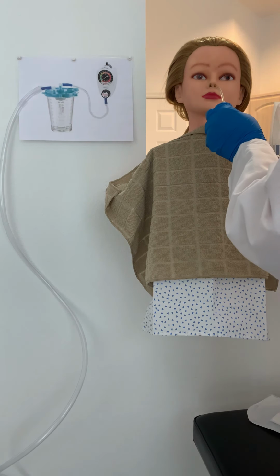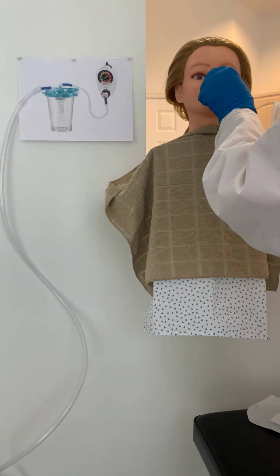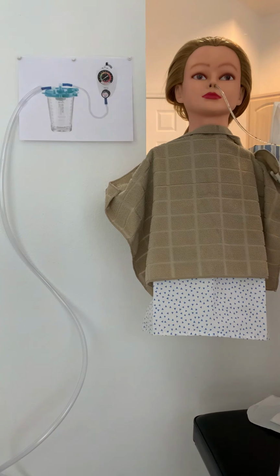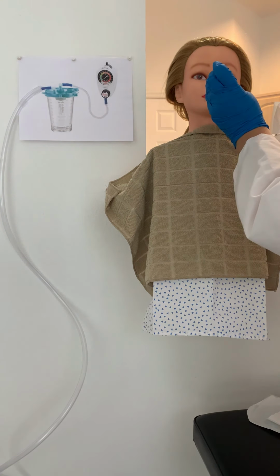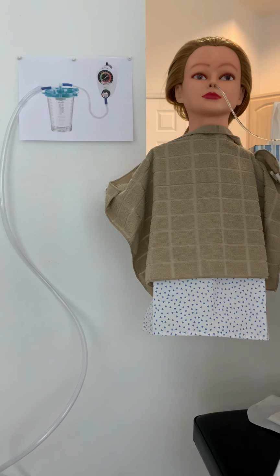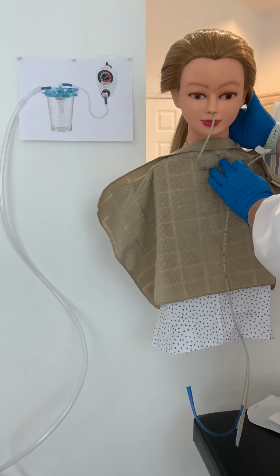So I'm going to go ahead and put this in. Just let me know when you feel it in the back of your throat. Okay, you feel it there? So go ahead and open your mouth and I'll just look and I can see the tube back there. So that's good. Okay, so now I'm going to have you tip your head forward. So chin to chest.